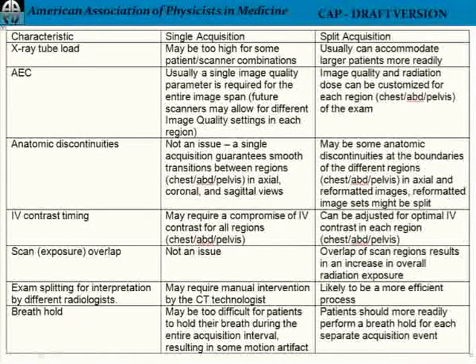The chest, abdomen, pelvis protocol is still in draft mode. This is one that I'm leading. The way this process works is one of the physicists takes ownership of getting this all put together. So one of the physicists continually harasses the vendors to give us their parameter sets, and then that physicist is in charge of compiling the entire document, making sure all the nitty-gritty details are worked in. I managed to sidestep all the previous ones, but it was finally my turn, and so I wound up with the chest, abdomen, pelvis protocol. So I know what this is because I actually made this table.